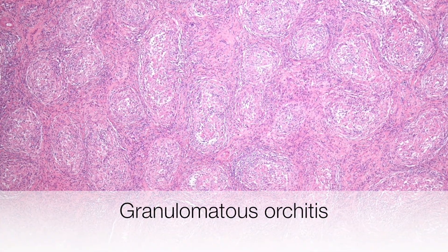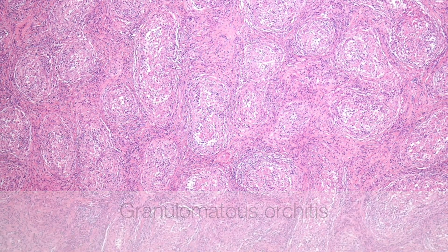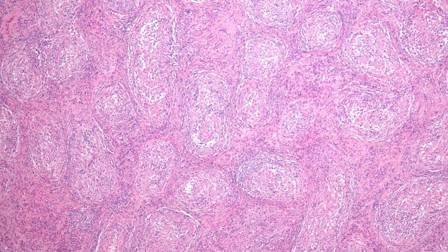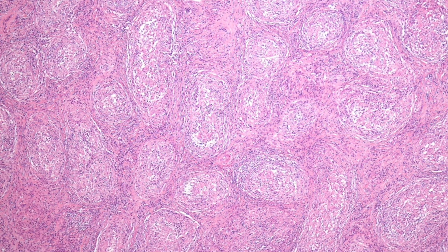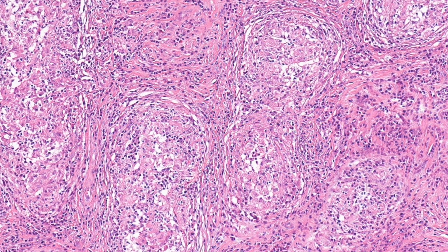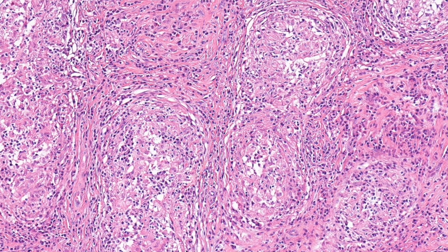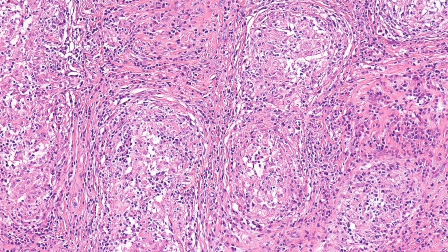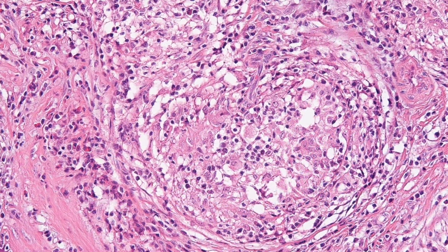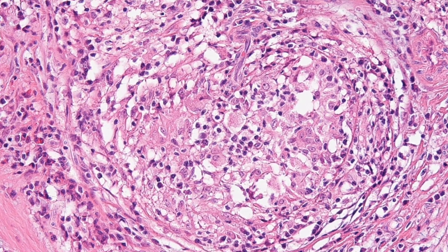This is the low power view of granulomatous orchitis and you can see that the normal tubular architecture is retained, but on higher power the content of the tubules is anything but normal and the germ cells have been replaced by inflammatory cells including macrophages, epithelioid cells, lymphocytes and plasma cells.